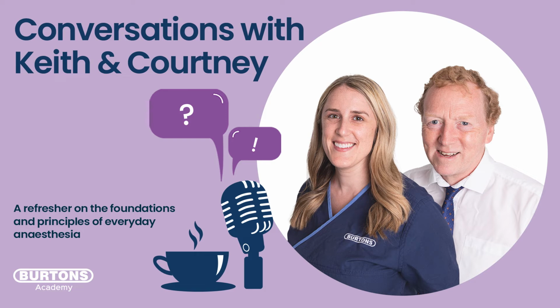Okay. So we've got 4 phases to our capnograph, and it goes 0, 1, 2, and 3. So in phase 0, we're taking a breath. Phase 1, we start to expire and clear those dead space gases. And in phase 2, we've got mixing of dead space gases and alveolar gas. So we start to have quite a rapid rise there before we plateau out.